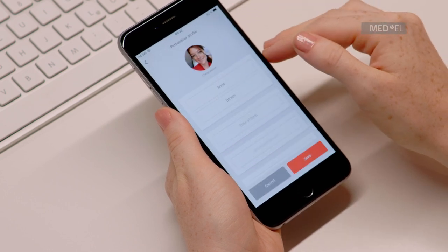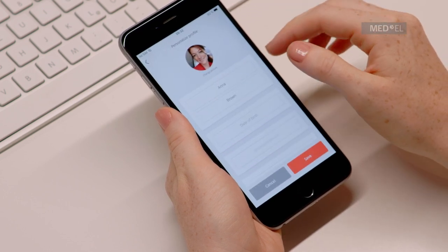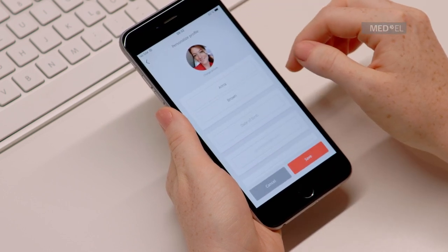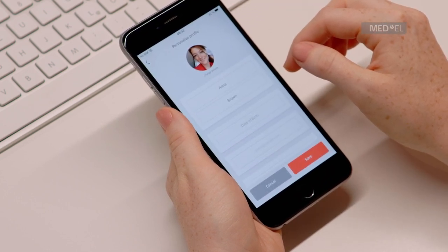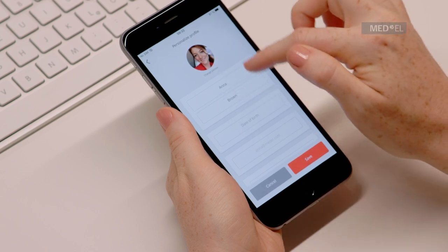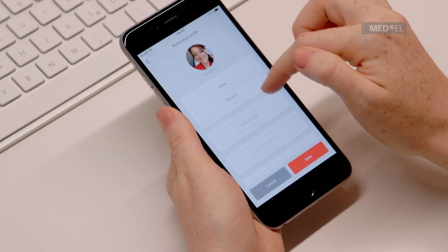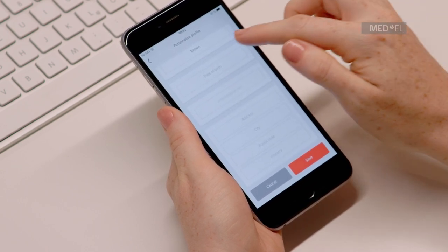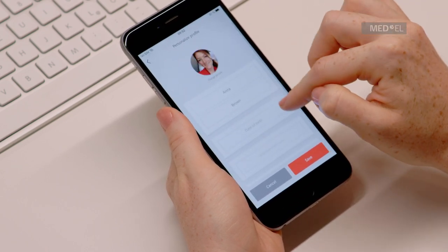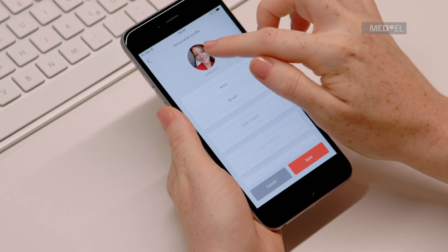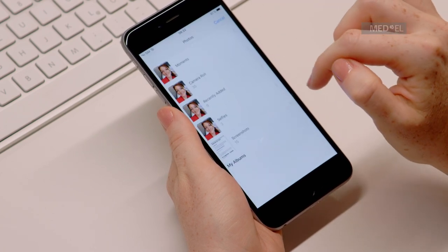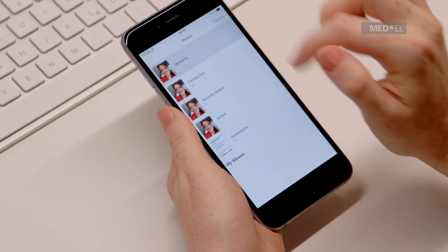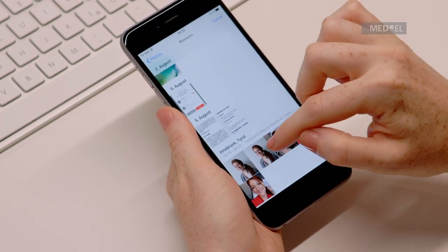Here you can add or change your personal details, such as name, date of birth, and your contact details. You can also change your profile picture. Tap on the picture, and then select a photo from your gallery.